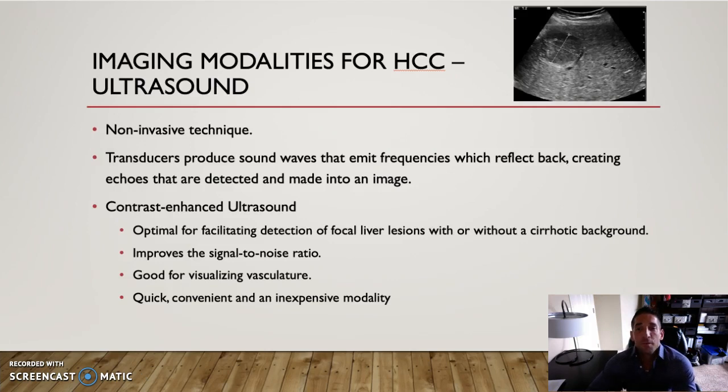Ultrasound is the preferred frontline imaging modality for diagnosing HCC because it's quick, it's convenient, and it's inexpensive. Ultrasound is a non-invasive therapy that uses piezocrystal transducers that produce sound waves. The sound wave emits a frequency which reflects back in the form of an echo, creating these images that are then placed onto a computer screen or a monitor.